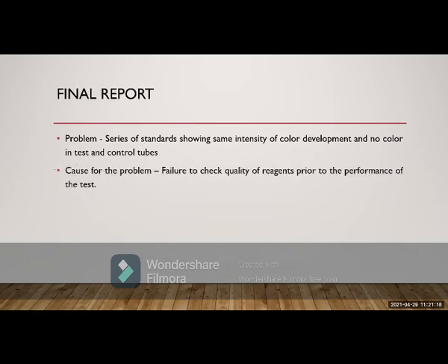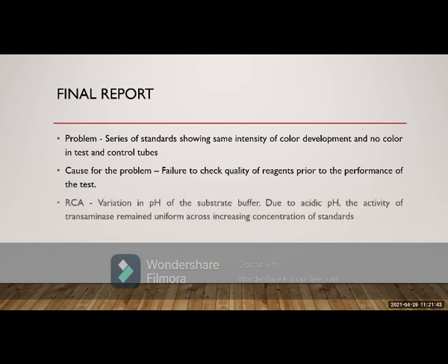Now, when we did the root cause analysis, we identified the cause for this problem. The cause was failure to check the quality of reagents prior to the performance of the test. If the quality check had been performed, we could have avoided this problem. So that is the actual cause of the problem: failure to check the quality of reagents prior to the performance of the test.